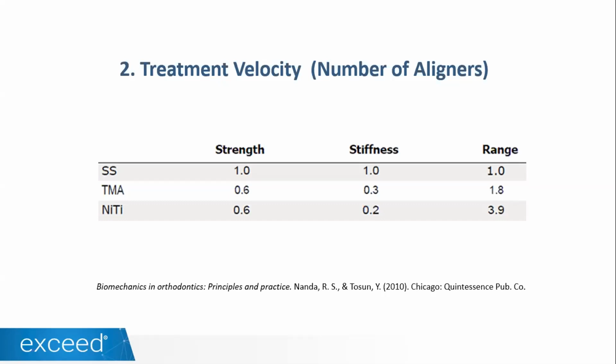You see the patient in 1 month. If everything is tracking well, you tell the patient, okay, now I'm going to give you 3 aligners, come back in 1 month. Use those aligners 10 days each. If that patient comes at the end of the month and everything is tracking well, then you can go to 7 days. And then you are actually making faster treatments without needing to increase velocities, and you are going to have more predictable results. And for me, this is better. I even have friends that use Propel.